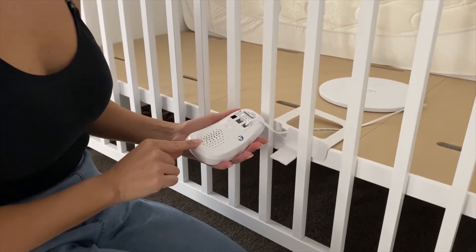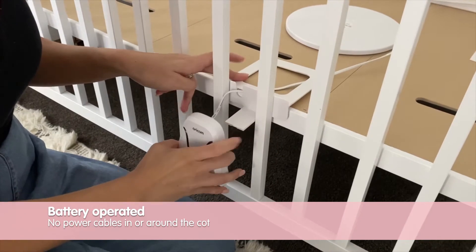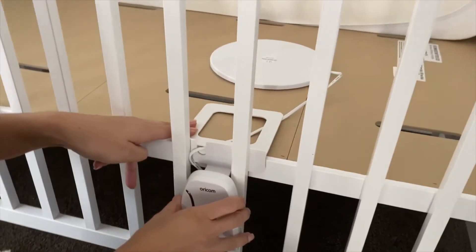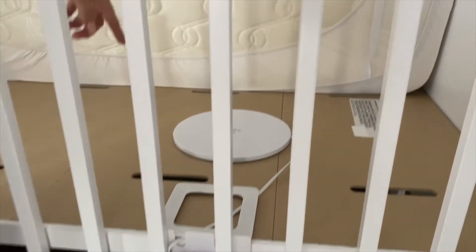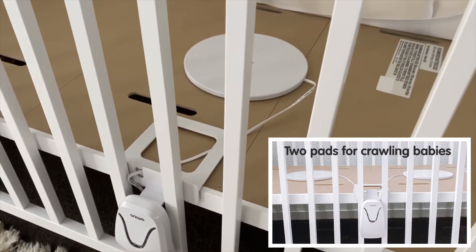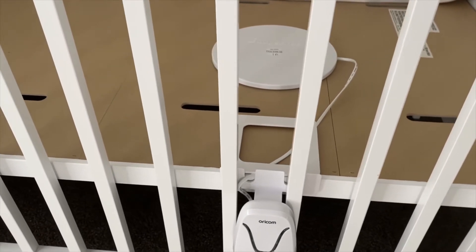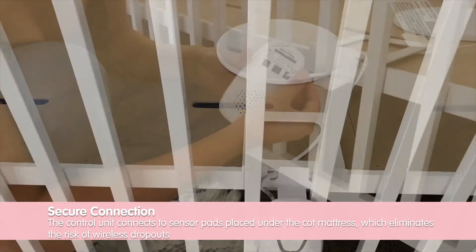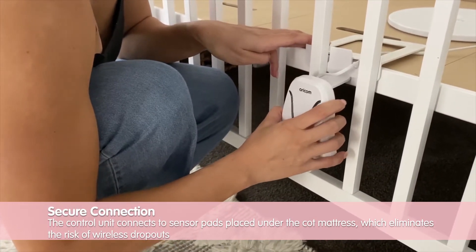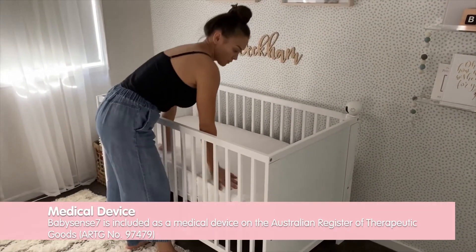The installation is easy with no direct contact with your baby. After inserting the four AA batteries, you simply place the control unit and its holder on the base of the cot by this hook. The control unit connects to these sensor pads placed under the mattress, or as shown, simply the one pad for babies who are unable to crawl yet. Simply pass the cords through these openings and attach to the back of the unit.